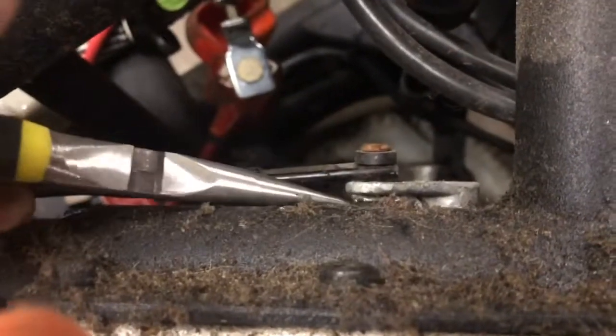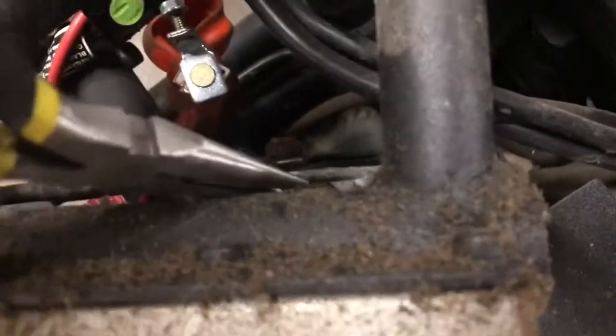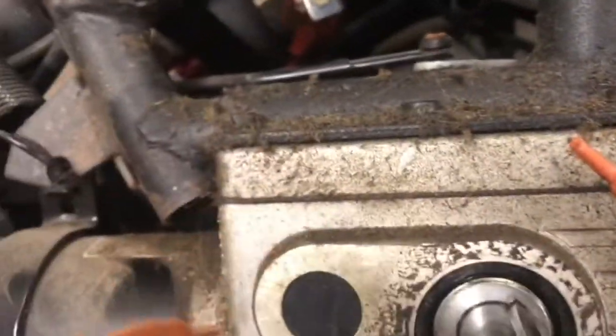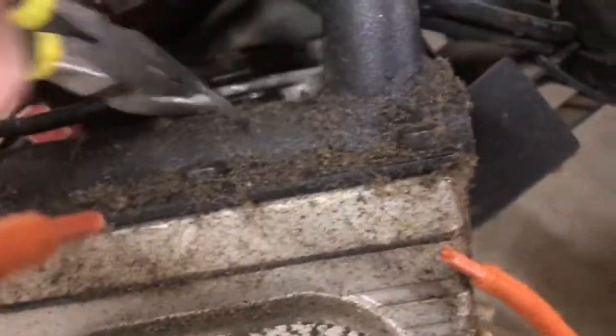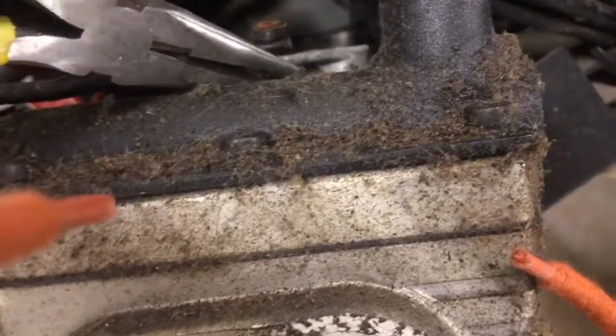Okay. Okay. And now what you want to do is you want to pull the big part right there. You don't have a lot of room here. This is probably going to be the most tedious part. Let me see if I get a different angle if I move this lever. Okay, it's not wanting to move. If you had a really small screwdriver, you could probably fit it in the hole of that and pull it out the other side. There we go, it's coming.